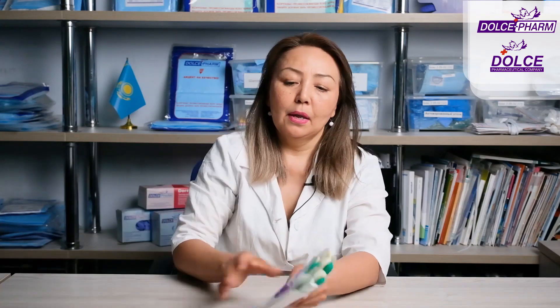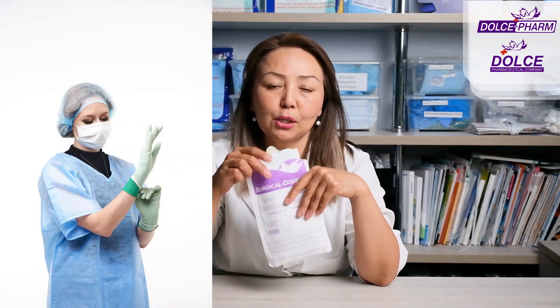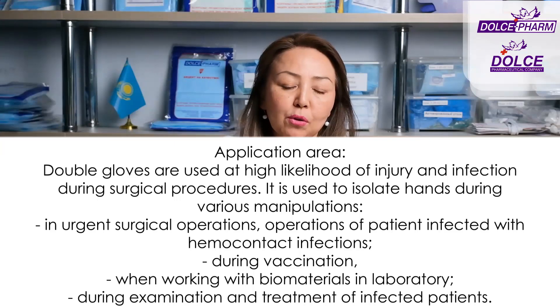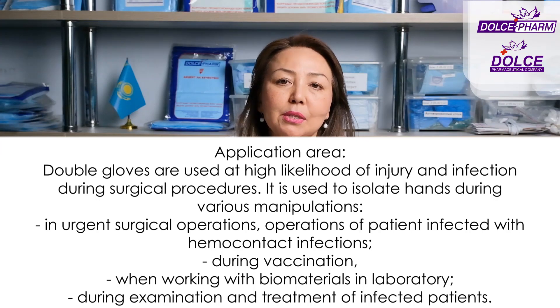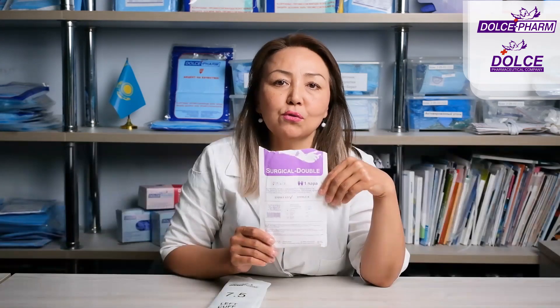Surgical Double. Here I am holding an already opened package of Surgical Double gloves. It's open because I will be showing the gloves to you while talking about them. When talking about medical gloves previously, I said that they can be examination gloves and surgical gloves, and that all surgical gloves are always sterile and always packaged individually.